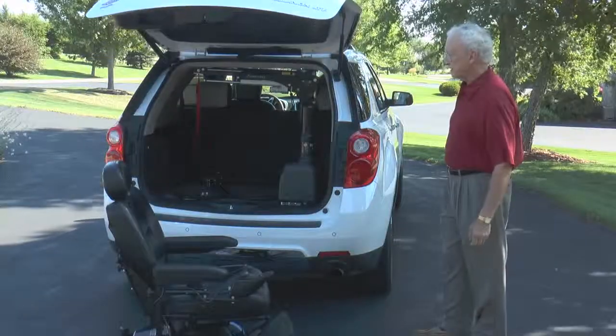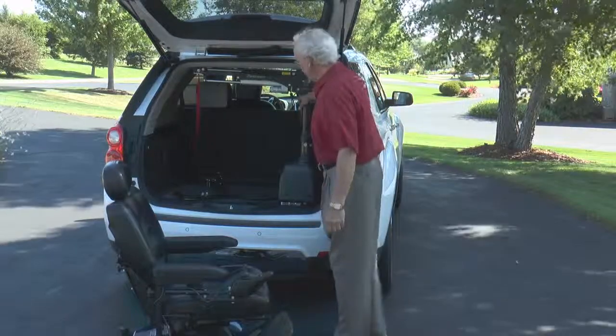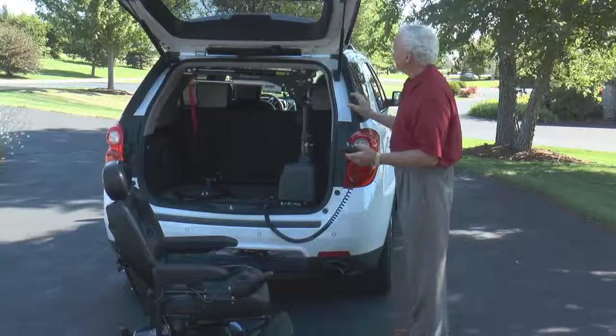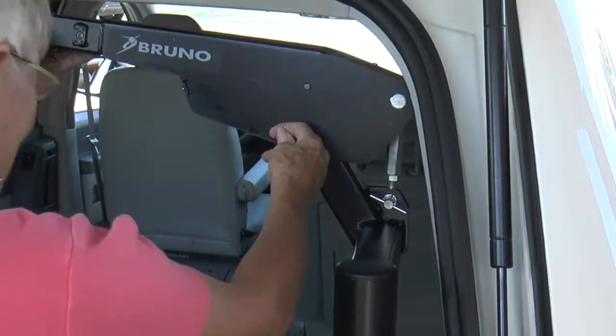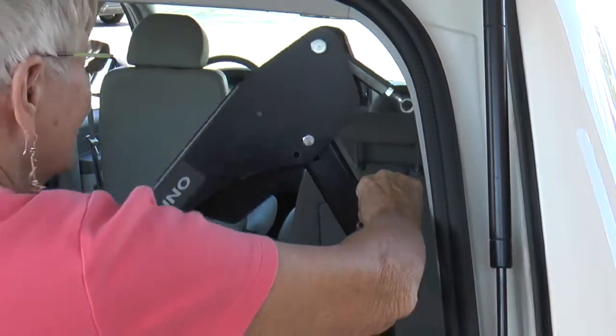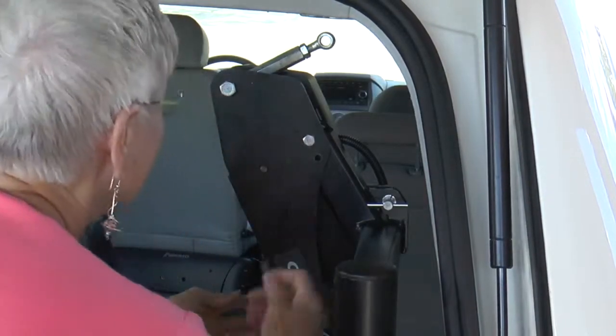With its compact design, the Curbsider takes up only a small corner of your cargo area to preserve maximum seating and storage. Fold down the lift head when your scooter or power chair is not present and the Curbsider is even more sleek, allowing for good rear-view visibility.